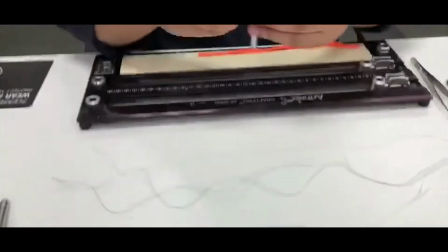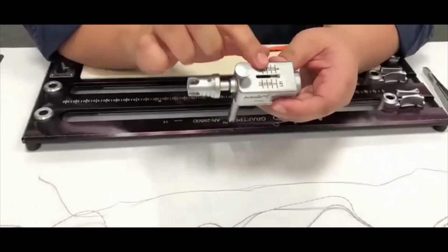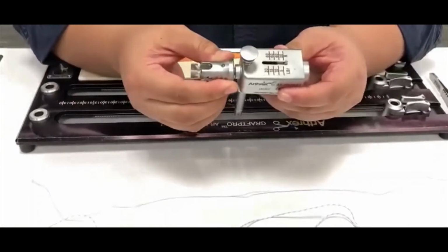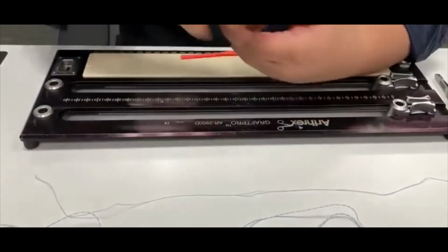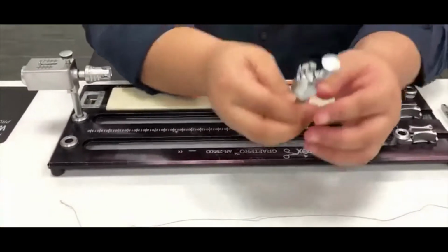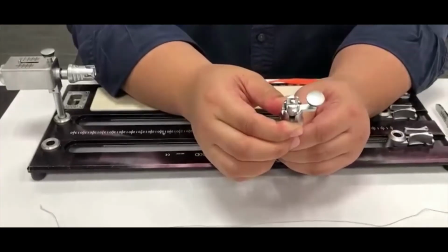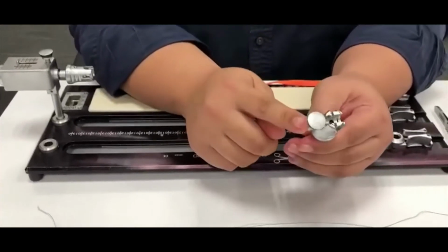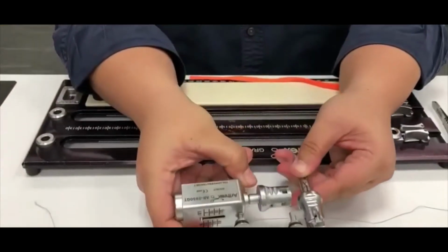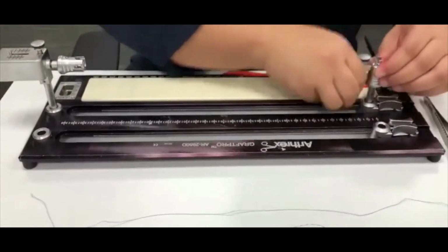Then the attachment that you need will be this attachment, which has the ability to tension the graft, and also has a button holder, which goes here. And then next we will require this attachment. This is also able to hold the button, but we're not going to use it. What we want to use is the rubber band as well. So both of the attachments have rubber bands. One is on the left, one is on the right.